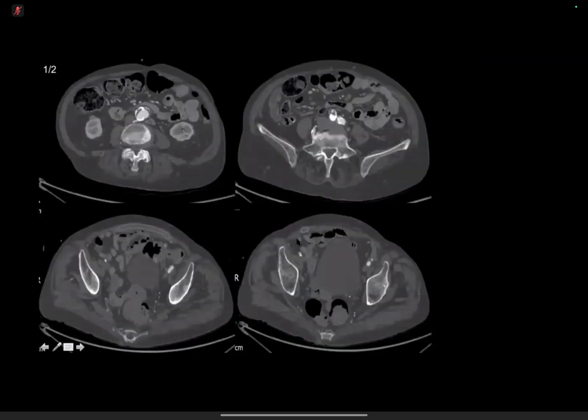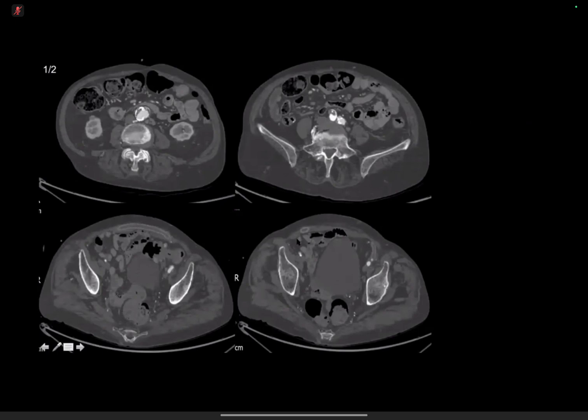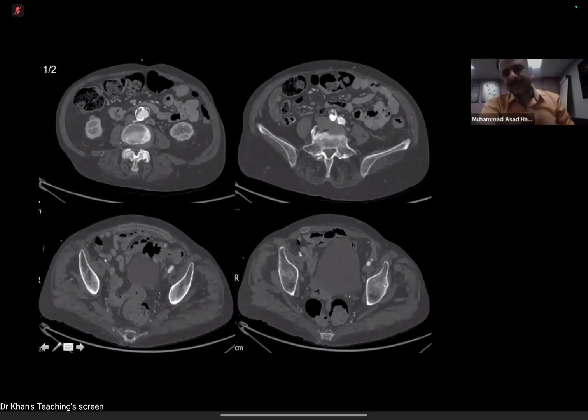I'd like to assess the runoff. Well, basically, the diagnosis is there. You made a comment about the graft, that you can see a graft. Any further comment about the filling of the graft? Totally occluded. Good. So you can see that there is a graft.